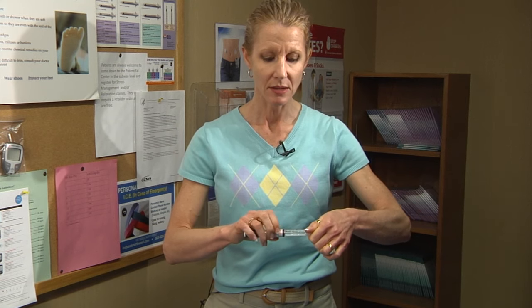When you're done, dispose of the pen needle in a puncture-proof container — a coffee can, a detergent bottle, a prescription bottle — something puncture-proof with a lid. Put the protective cap on and turn counterclockwise to remove the needle. Lastly, make sure the pen cap gets back on to protect the insulin from light.